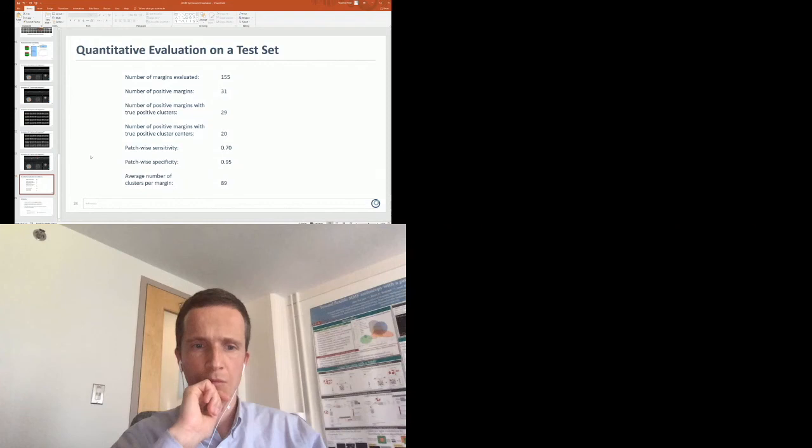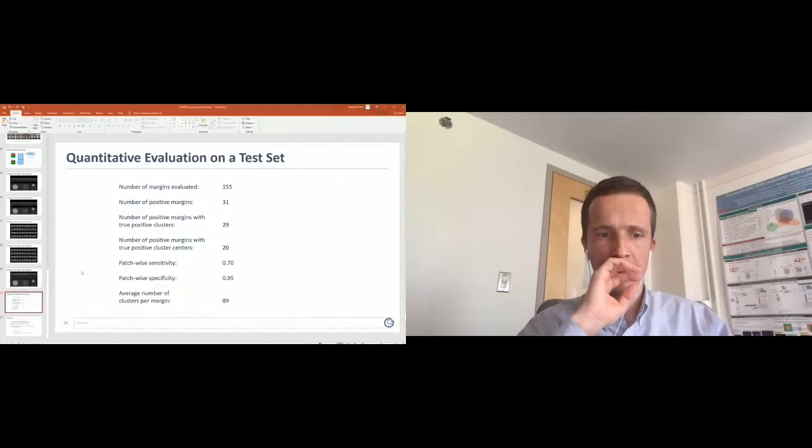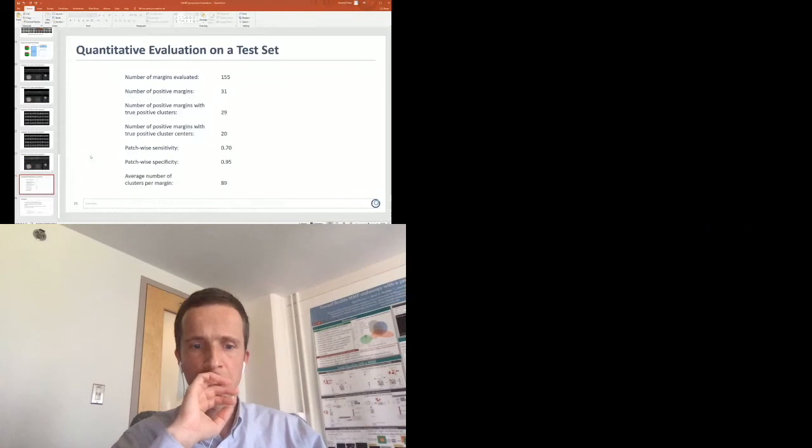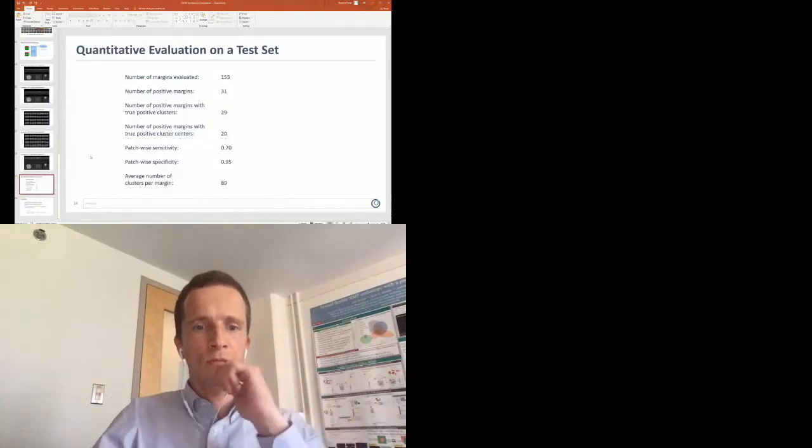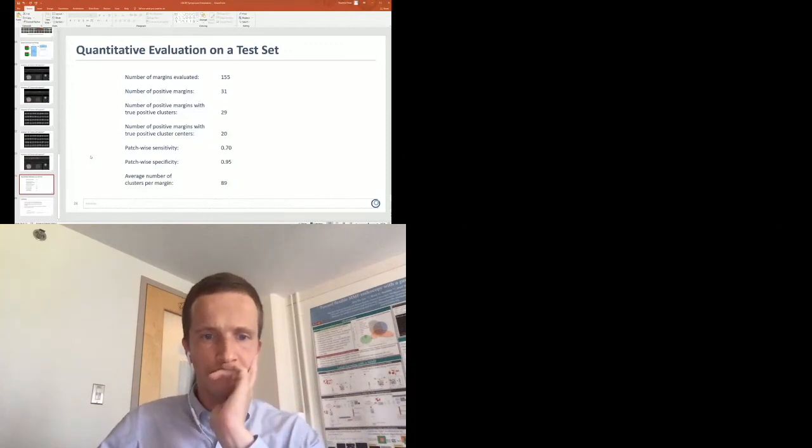So I was hoping to present results of clinical assessment, but the results are still under processing. We had a reader study underway, where clinicians evaluated a test set of 40 margins and were able to identify the majority of them correctly within a couple of minutes, just 2 to 3 minutes, which is a really promising result, we think.